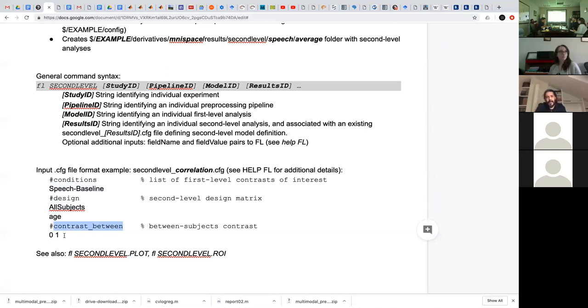And this is all in line with that other presentation where we talk about the design matrix and how to specify a few contrasts, and how to remember that 1 minus 1 looks at the difference between two effects or the difference between two conditions or things like that. The typical contrasts look like everything is 0 and a 1, or something that looks like a 1 minus 1, and then it may have additional zeros.